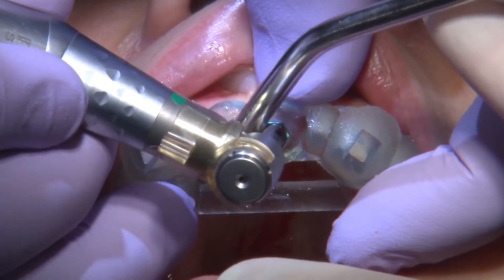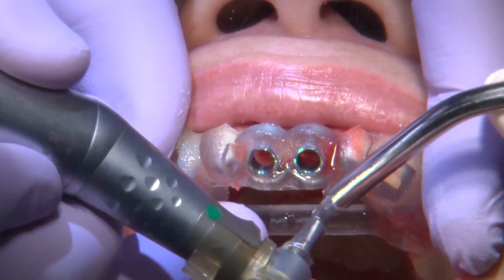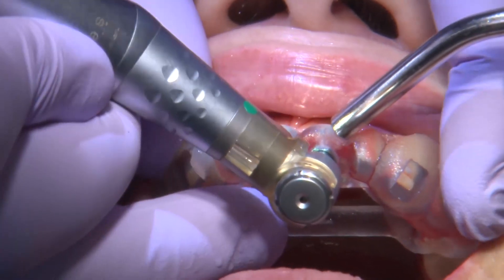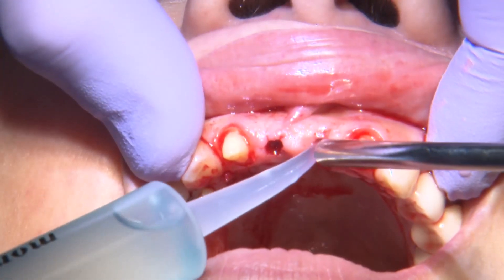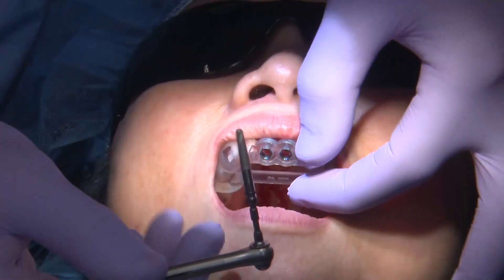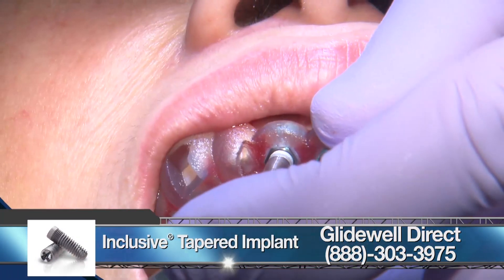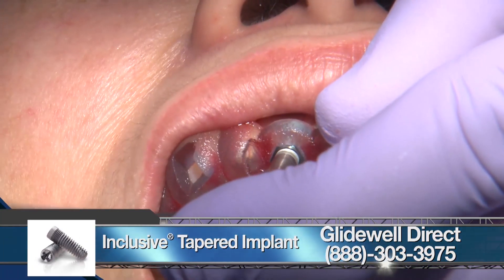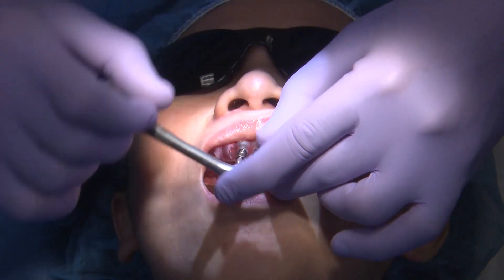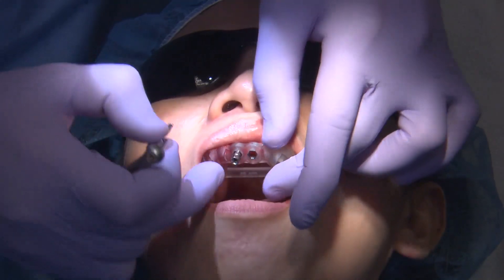Going through with the guided surgery, I removed the soft tissue and utilized osteotomy drills until the last osteotomy drill matched the size of the implant. I then placed the implant through the sleeve of the surgical guide. This is a tooth-supported surgical guide, and the patient can receive those implants in the precise location that we had planned.